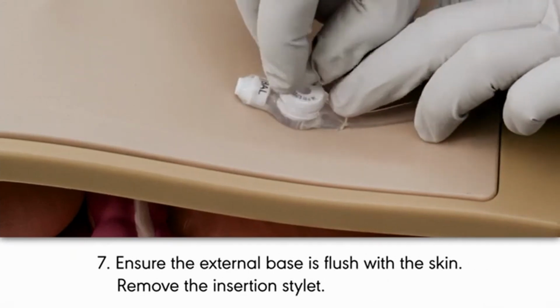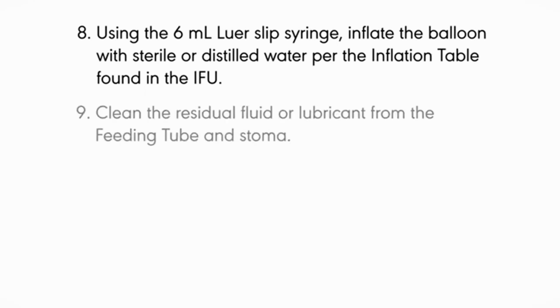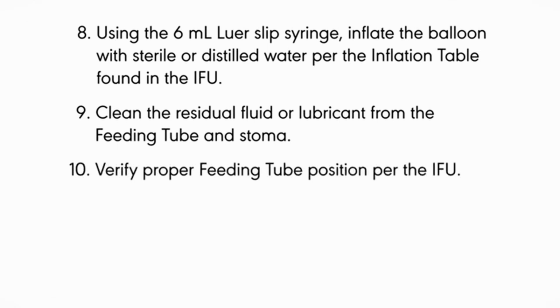Remove the insertion stylet. Using the 6 milliliter luer slip syringe, inflate the balloon with sterile or distilled water per the inflation table found in the IFU. Clean the residual fluid or lubricant from the feeding tube and stoma. Verify proper feeding tube position per the IFU.